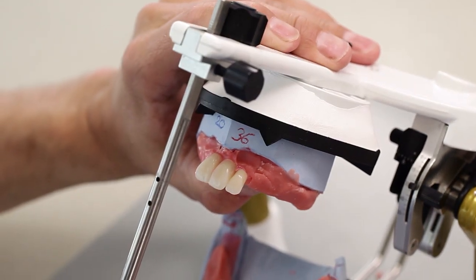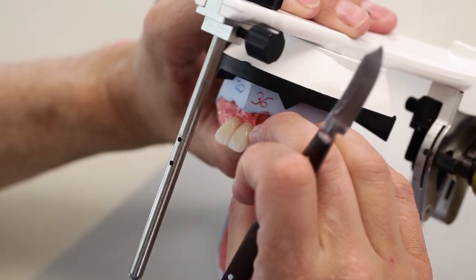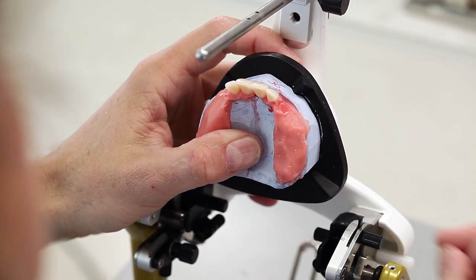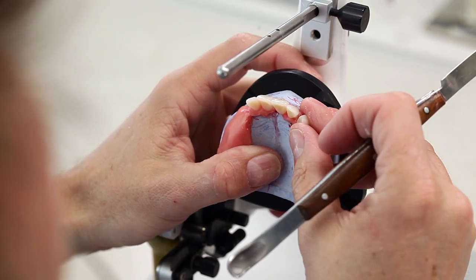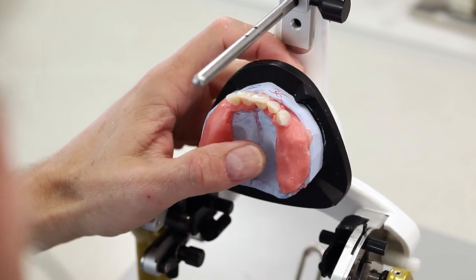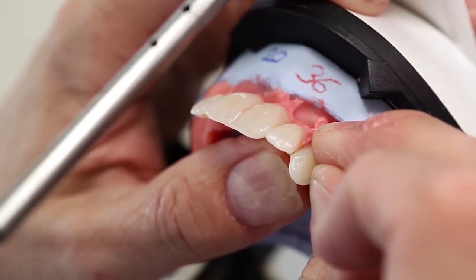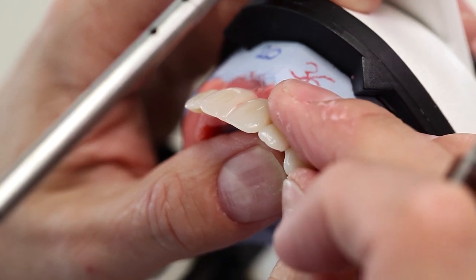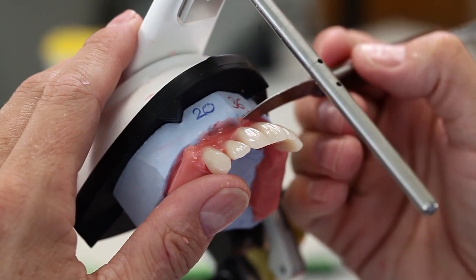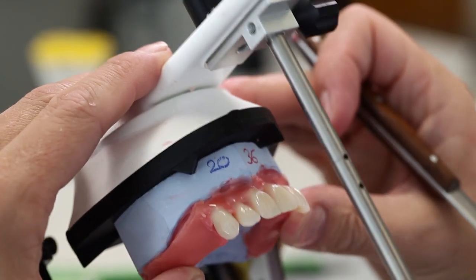Their labial curvature harmoniously blends in with the vertical anterior tooth arch. The position of the canines is of decisive importance for the function and aesthetic appearance of the setup. The symmetric positioning of the canines, the most distinctive teeth in the maxillary anterior region, facilitates the setup. The canines are again set up perpendicular along the longitudinal axis. Ideally, the distal ridge runs parallel to the sagittal course of the alveolar ridge.